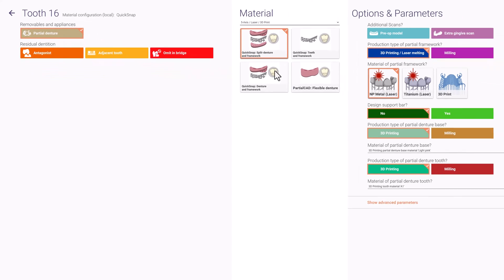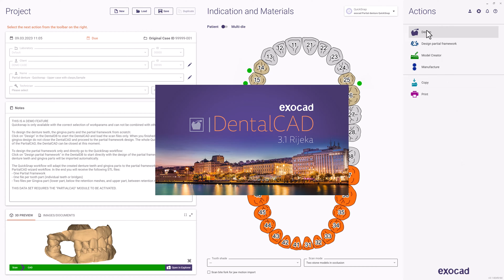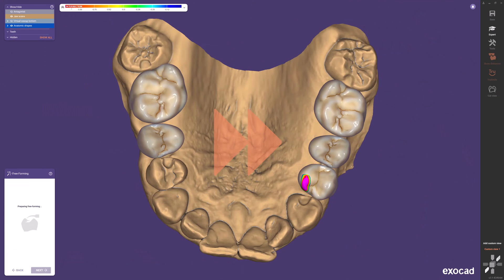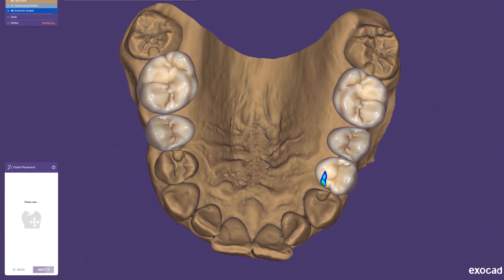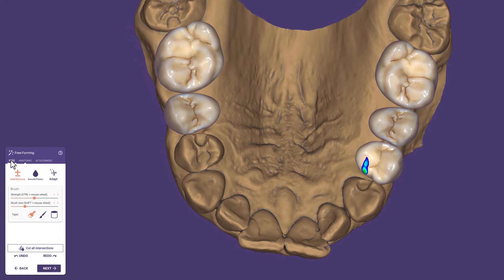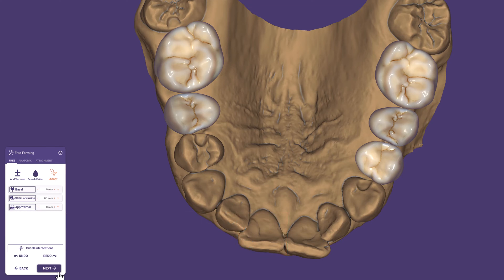To start the Quick Snap workflow we click on Design for our DentalCAD. Here we set up the teeth and design the gingiva in advance. If a classical partial framework is what you need, you can skip this step and click the partial cut button to start the framework design right away. Please follow the usual cut steps for a case with gingiva design, then set up your library teeth in the tooth placement step and proceed to free-forming, where we adapt occlusion and proximal areas. It is recommended not to adapt the basal areas of the teeth now, to achieve optimal adaption to the framework and gingiva later.